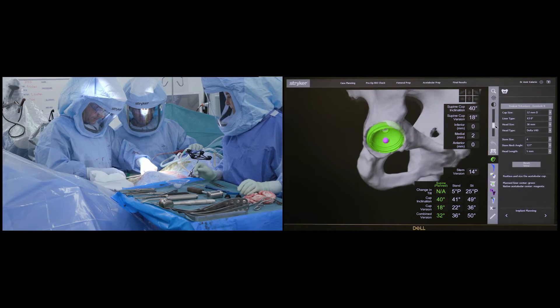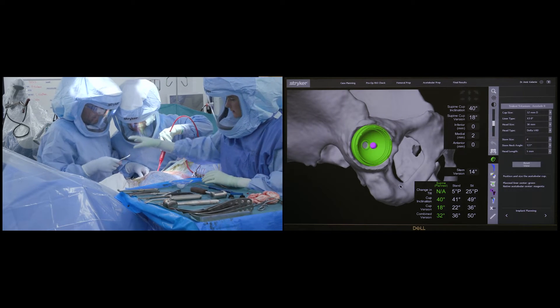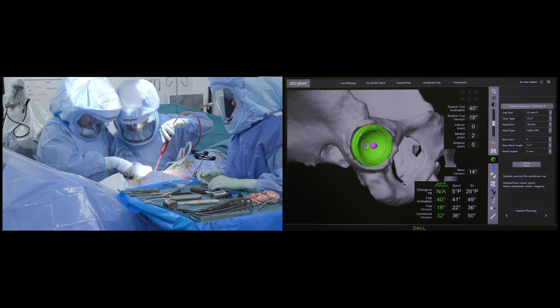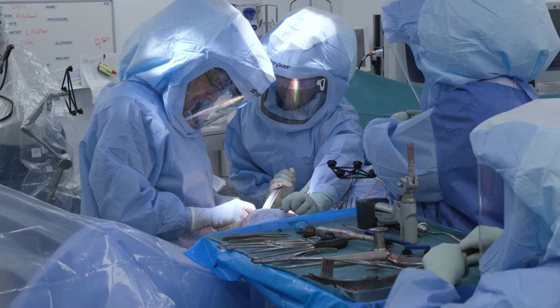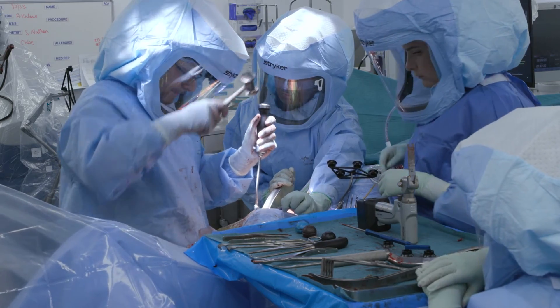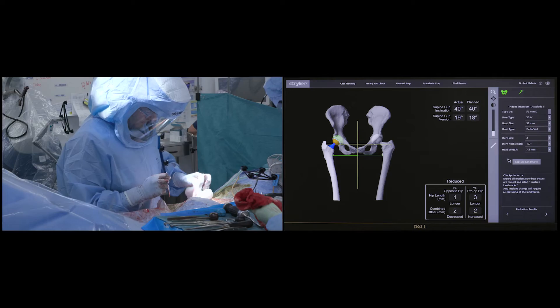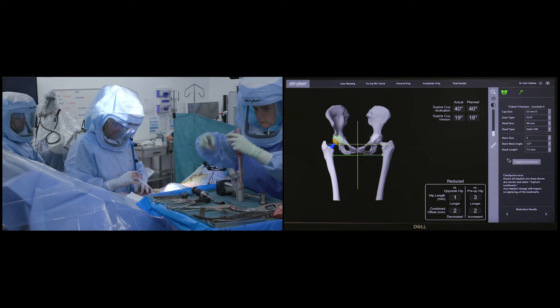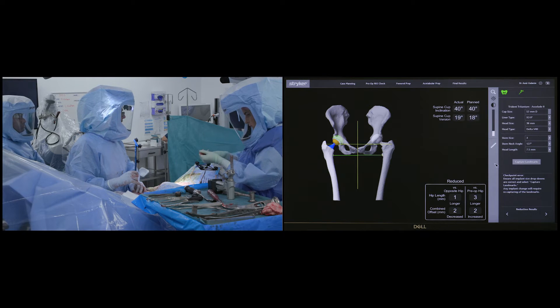As seen in the right-hand picture, the patient's anatomic central rotation has been restored with a high degree of accuracy, with no change in the north-south axis and only two millimeters of extra medialization. The patient's leg length has been increased by three millimeters, which is exactly what was planned, and the combined offset is increased by only two millimeters — negligible, and confirming restoration of the patient's anatomy.